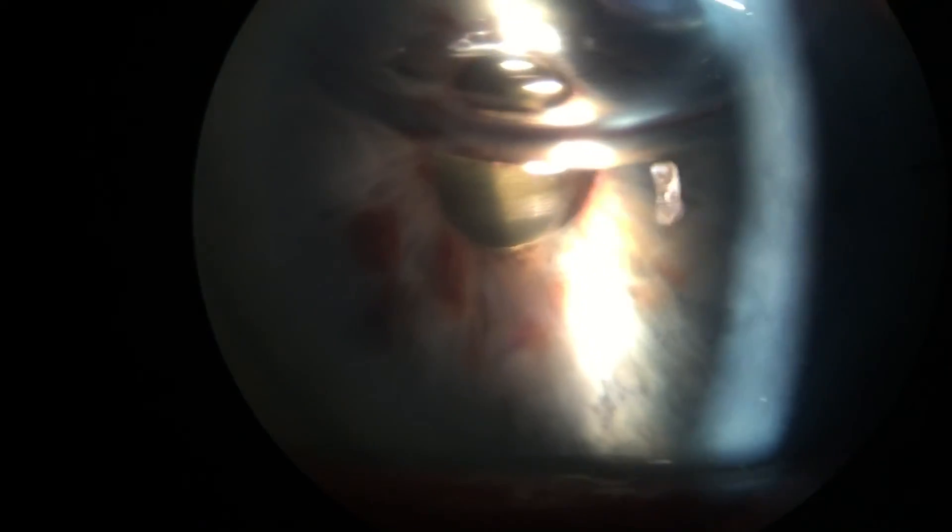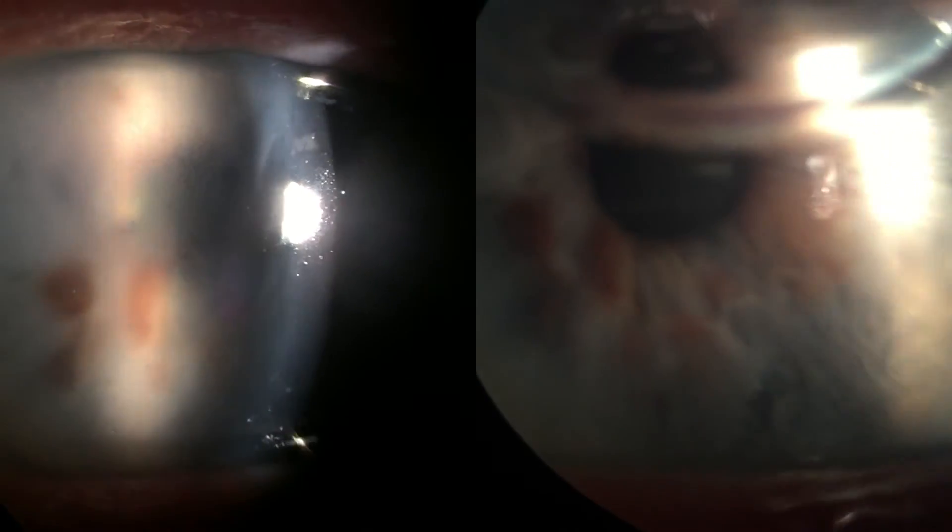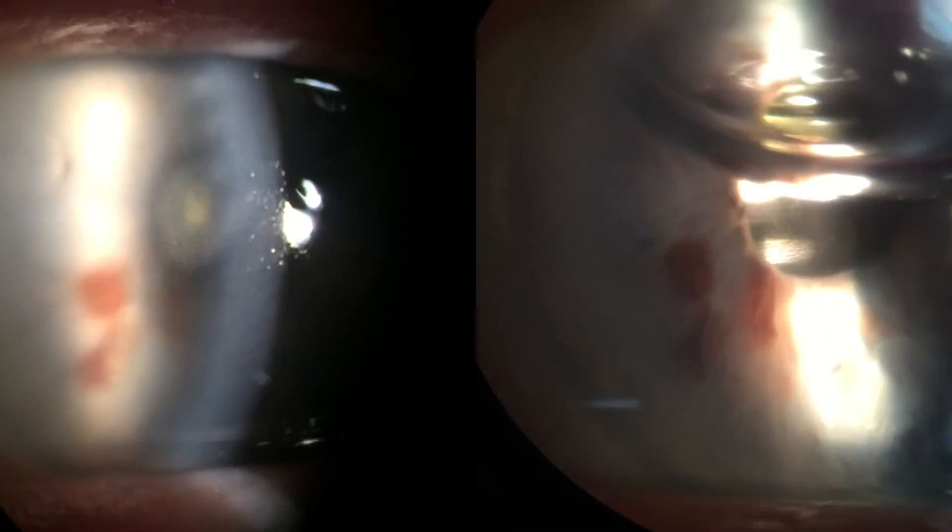The results have been amazing. This is the post-operative day one appearance — the appearance of this patient's eye less than 24 hours after surgery. The cornea is crystal clear. What you see here is a residual air bubble in the anterior chamber. A side-by-side view shows the pre-operative view on the left and the post-operative day one view on the right. The relative improvement has resulted in the patient seeing 20/30 the day after surgery despite the fact that there's still an air bubble in the eye.